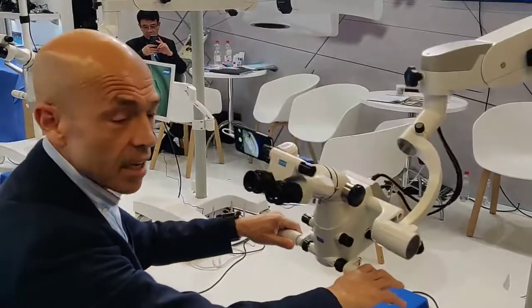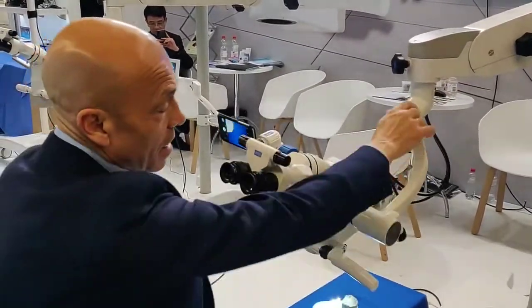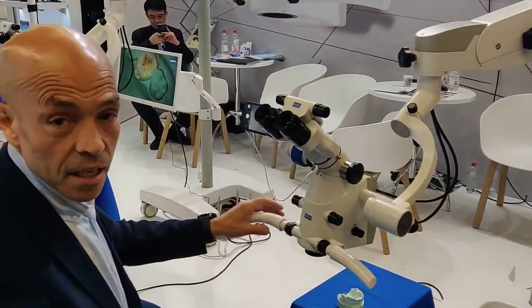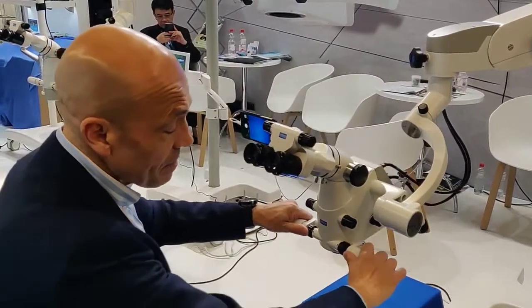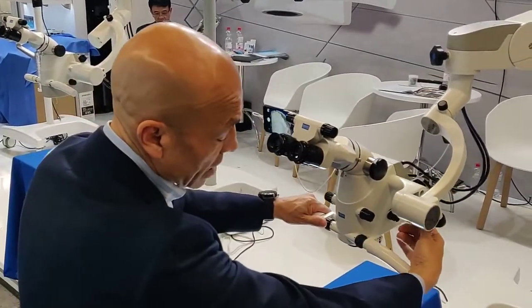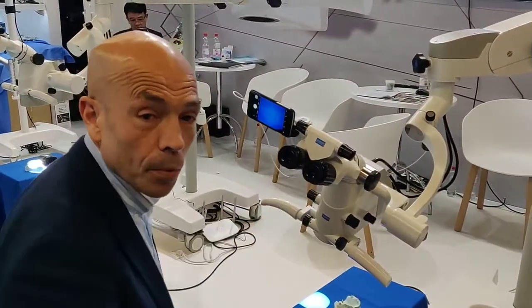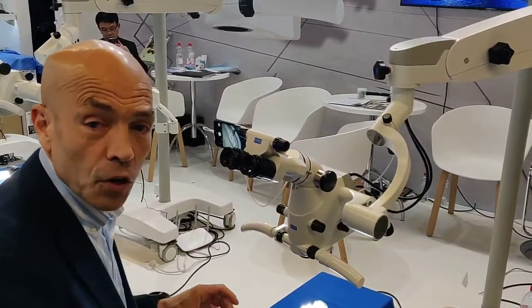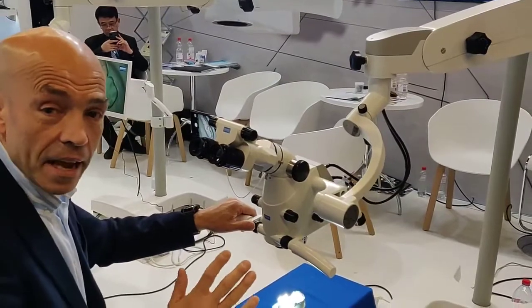The microscope, as you can see, is extremely easy to handle. At the same time, it can be very easy to manage even if you have some weight on the side. But if you want, you can fix it so that you can use it and put it in a certain position that you like to have, without being difficult to move. So this is the first thing: outstanding handling.